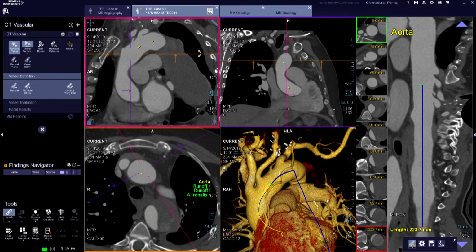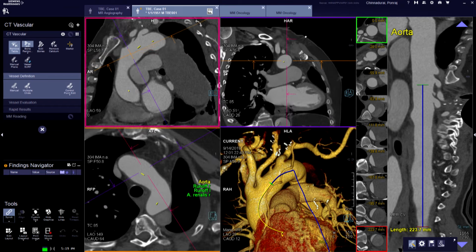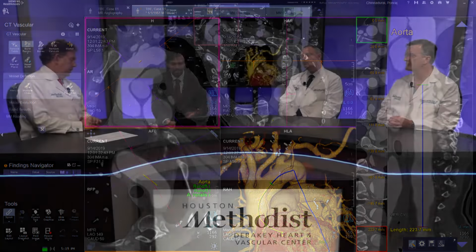And again, even though we are talking about automated processing, there are certain things, like driving a manual car, where we also need to know how to shift, right? One of the most key things in learning imaging is how you familiarize yourself with working with multiplanar views, like what I'm talking about here. Dr. Lumsden, maybe you have learned this over the last few years. Maybe you can pitch in a little bit about how critical it is.